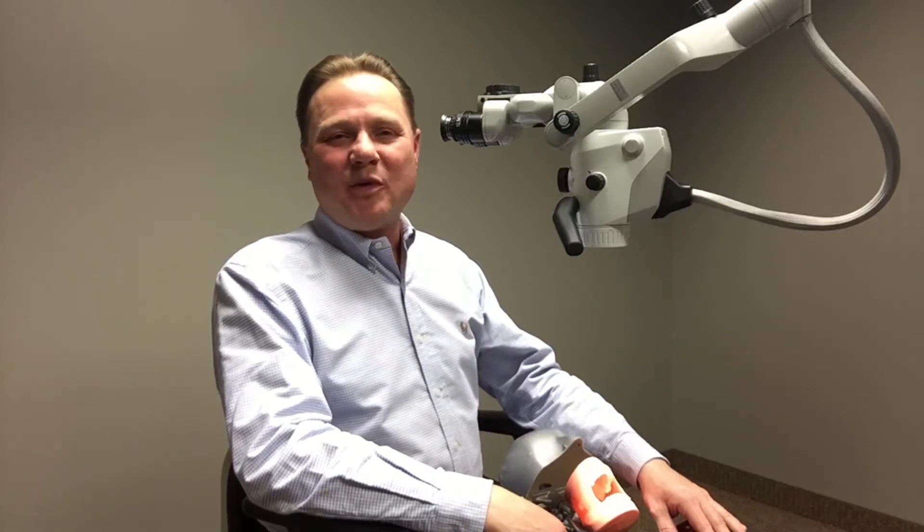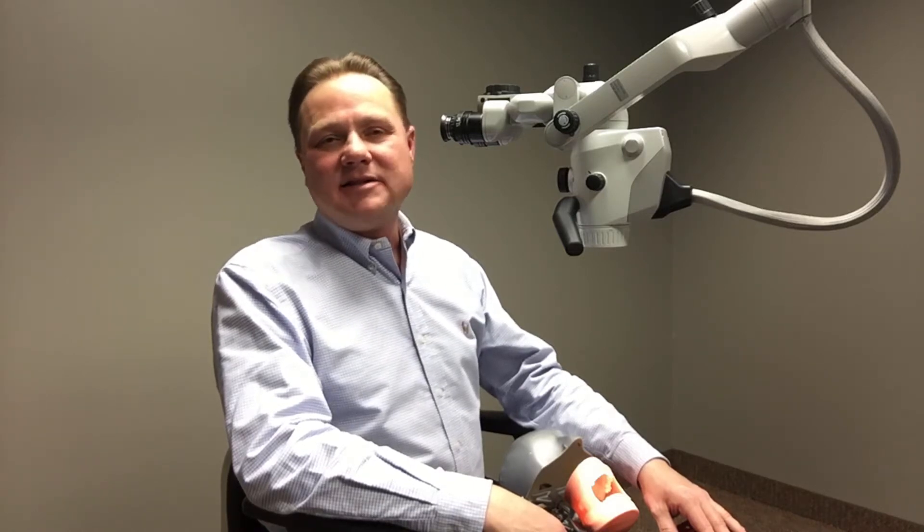Hello, my name is Tim Van Wyken, and I'm the factory representative with Carl Zeiss Microscopes here in the Midwest Marketplace. I'd like to take a couple minutes and introduce you to the newest dental operating microscope, Xtero.